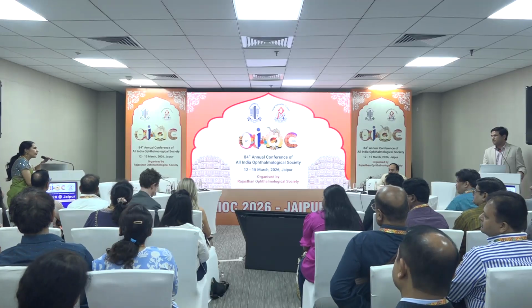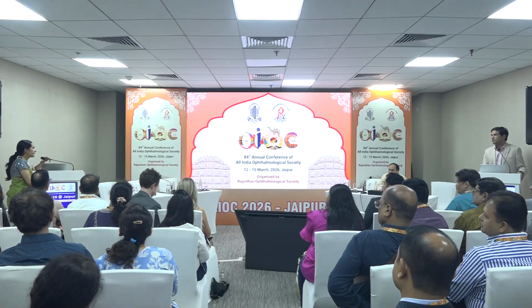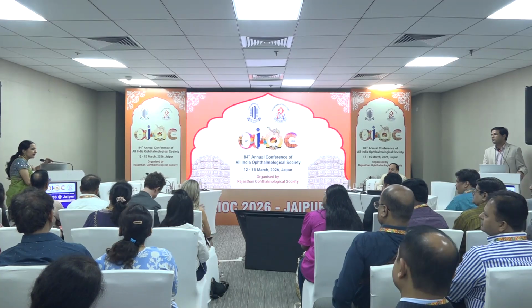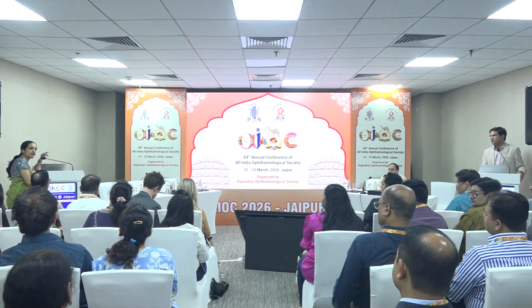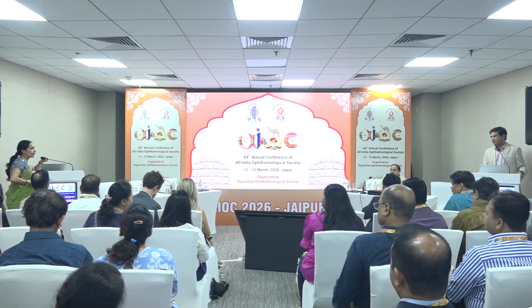Plus, in terms of formulae, you very rightly said that we all learned that Hoffer Q is the best for short eyes. Now with the newer formulae, my personal preference is the Barrett group of formulae. And also the Kane and Evo, the Kane also is an AI based formula in parts. These are also coming up very, very good. So I think that is what is needed.